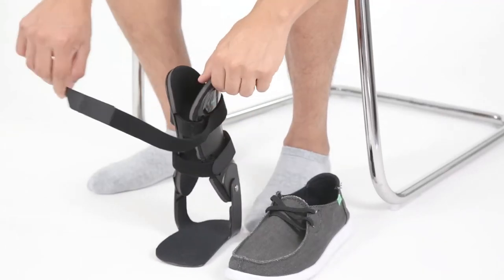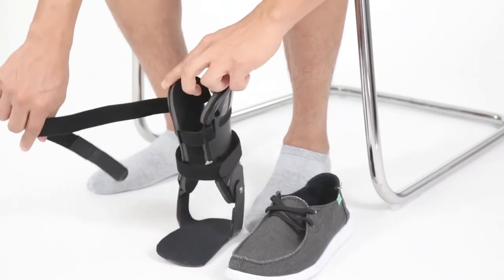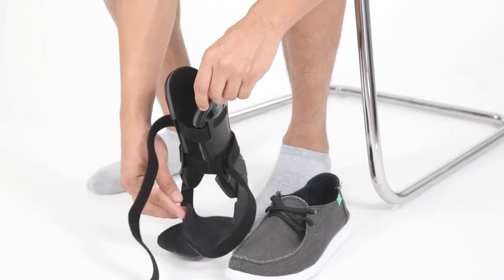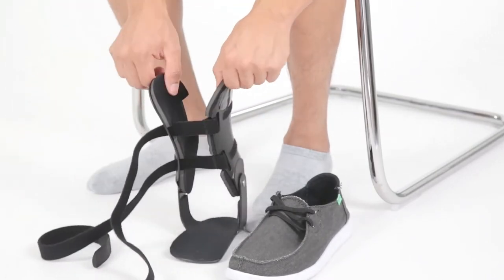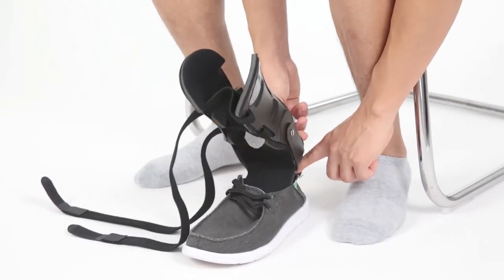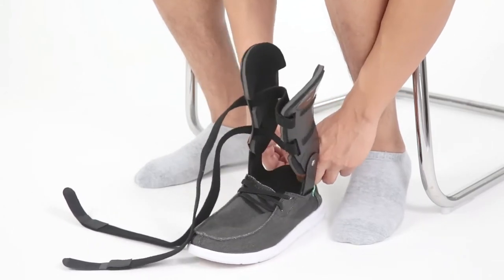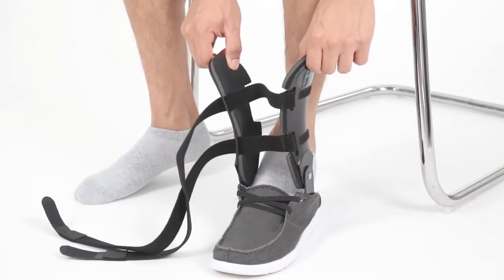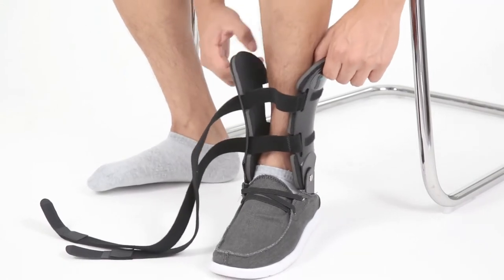To put on the Cortec 906 Motion Ankle Brace, start by loosening and opening the two straps. Then insert the plastic base of the ankle brace into your shoe over the existing shoe insole. Next, insert your foot through the brace and into the shoe so that your foot stands on top of the plastic base.